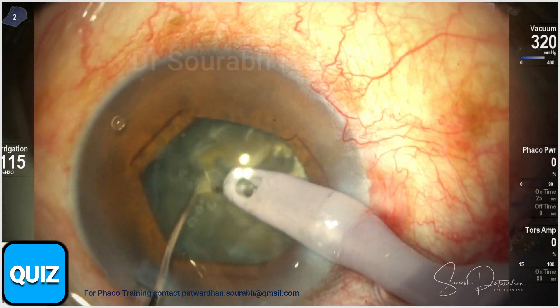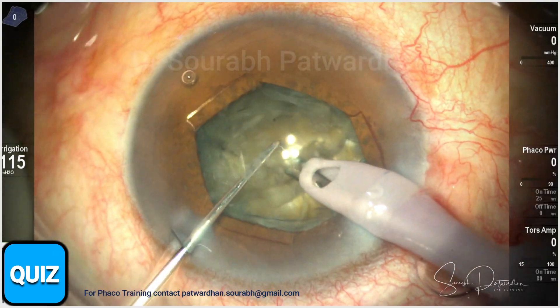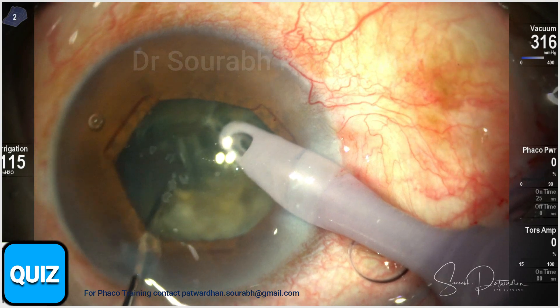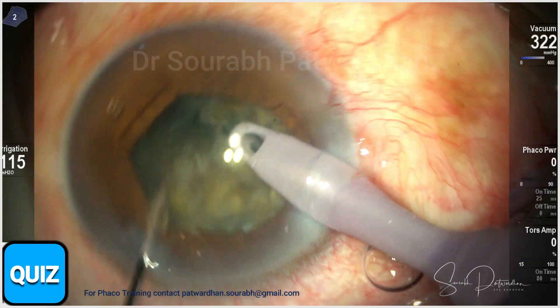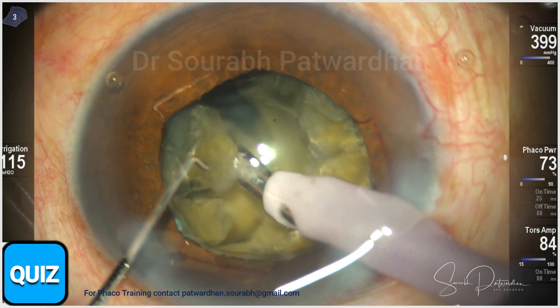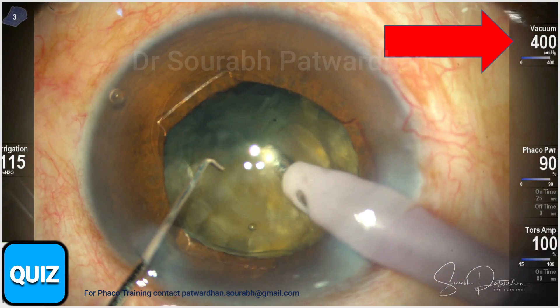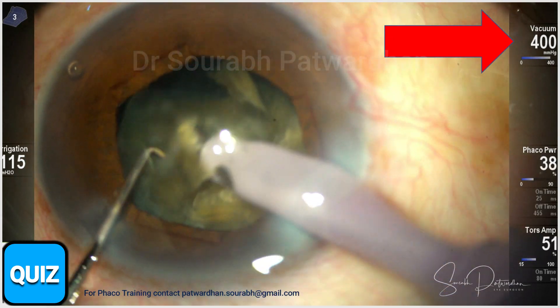This is a long-standing cataract, and we want to do safe phacoemulsification using good, heavy dispersive OVD to protect the endothelium. The trick is making small pieces out of the hemi nuclei, and now I'm going to start the quadrant removal.